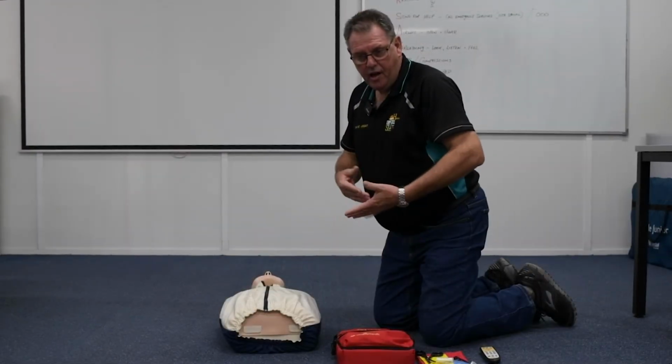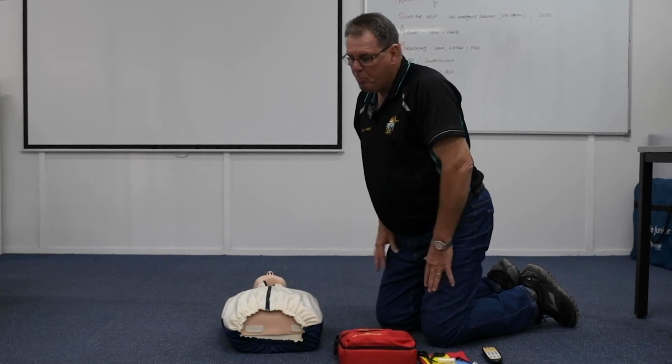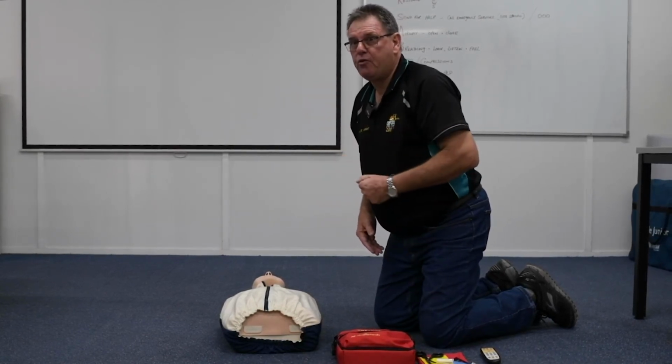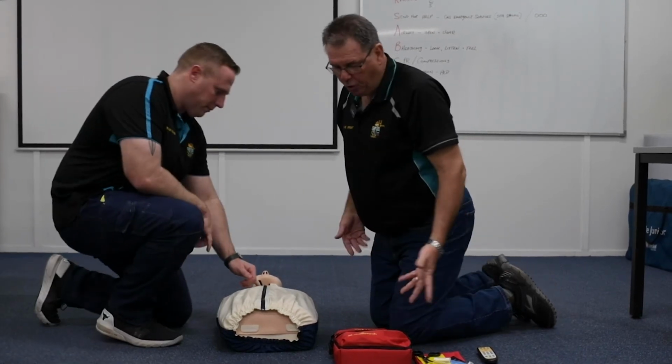So now, following our little introduction into the defib, we're now going to ask Wade to come on through, and we're now going to run through the operation of the defib.